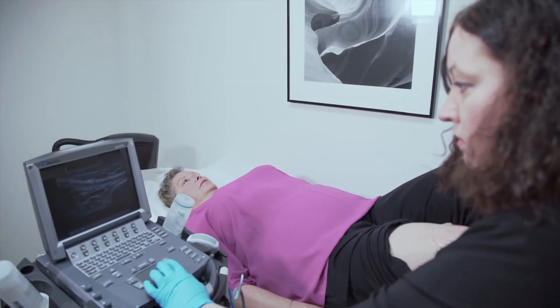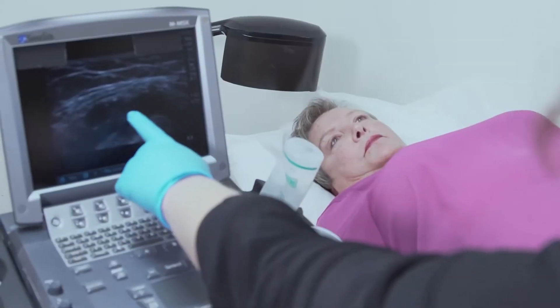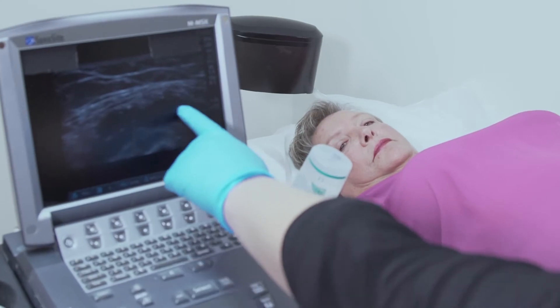We use a musculoskeletal ultrasound. It is a test that is very easy. There is no radiation involved, so we will examine with a probe so we can see the inflammation under the skin. It's not painful, and it's a very easy and quick exam.